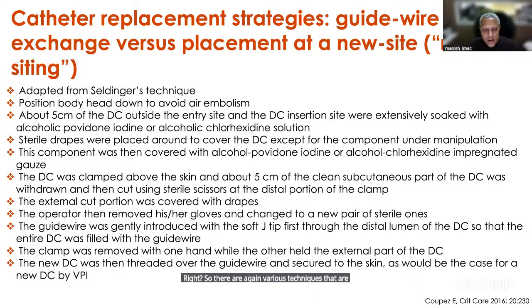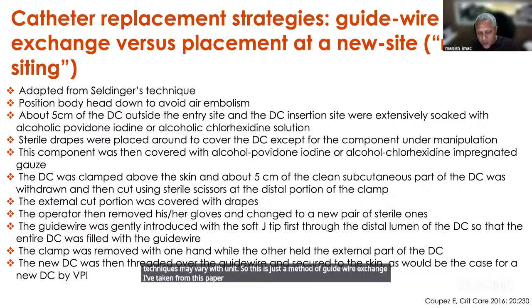These techniques may vary with unit. So this is just a method of guide wire exchange I've taken from this paper, the paper that I just showed you. And this was the method that they used for guide wire exchange.